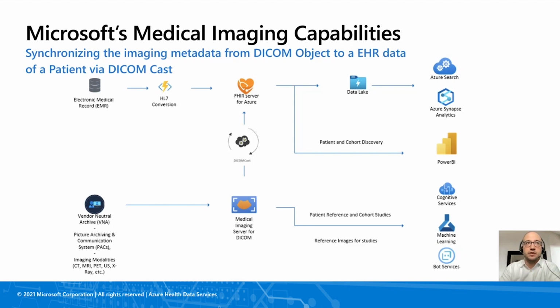So for example, if a new image is ingested and there's an indication that a follow-up action is needed, the radiologist note can also be used to trigger an event for the next steps for the patient.